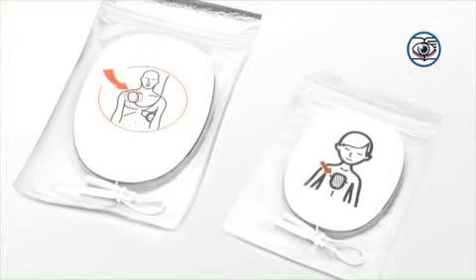Infant AED. It is extremely unlikely to ever have to defibrillate a child less than 1 year old. Nevertheless, if this were to occur, the approach would be the same as for a child over the age of 1. The only likely difference being the need to place the defibrillation pads anterior, front, and posterior, back, because of the infant's small size. Simple identification differences between the two types will be made on the packaging.